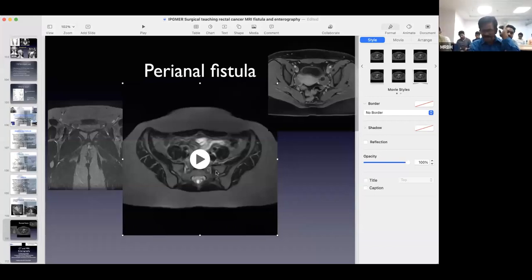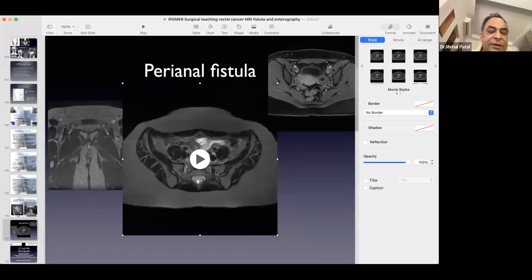Usually, as I said, these pictures are not given in the exam, but they are difficult for the surgeons to interpret. To be honest with you, I must put in some newer pictures because these are still very old. The newer scanners are a lot better, so you identify the anatomy a lot better. But are there any questions from the boys?